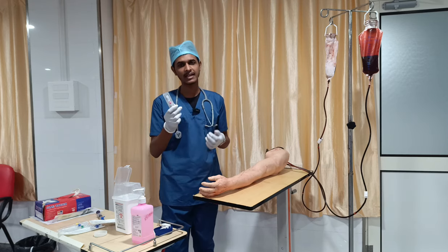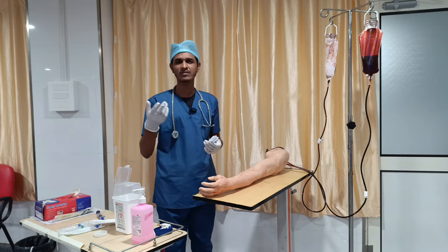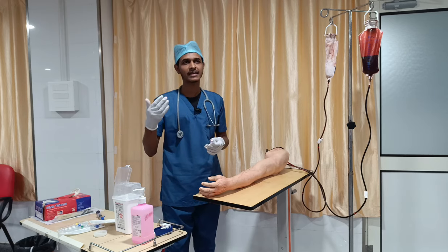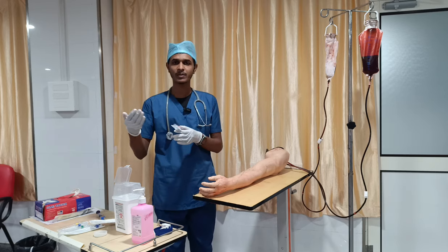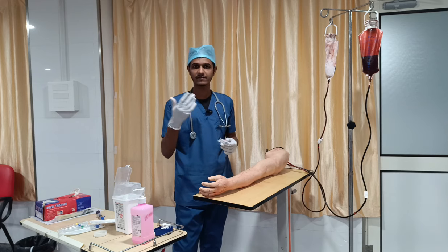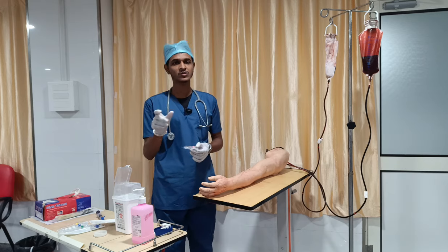Based on that you have to select your cannula, and based on that you have to select your vein also. If it is maintenance fluid, you can go with some smaller veins, like a metacarpal. If it is some irritant medication, or if you want to give more aggressive fluid, you have to go with the cephalic region or the cubital, antecubital region. Or the brachial region, with the guidance of USG, you can also go for. So based on the purpose you have to choose both the catheter and the site.